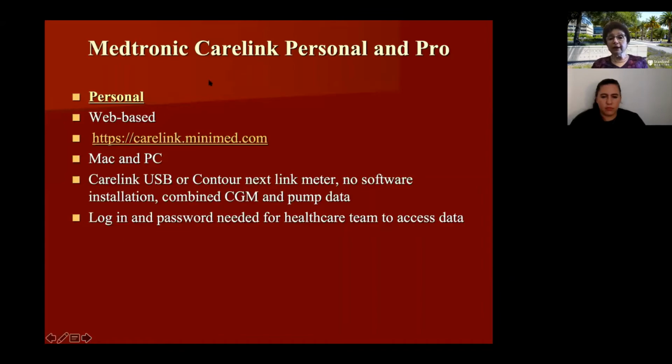For Medtronic, it's CareLink Personal. CareLink Pro is now the same as CareLink Personal. It's carelink.minimed.com. Also very great reports for both Macs and PCs. You can download through the ContourNext Link meter. No specific software is needed.